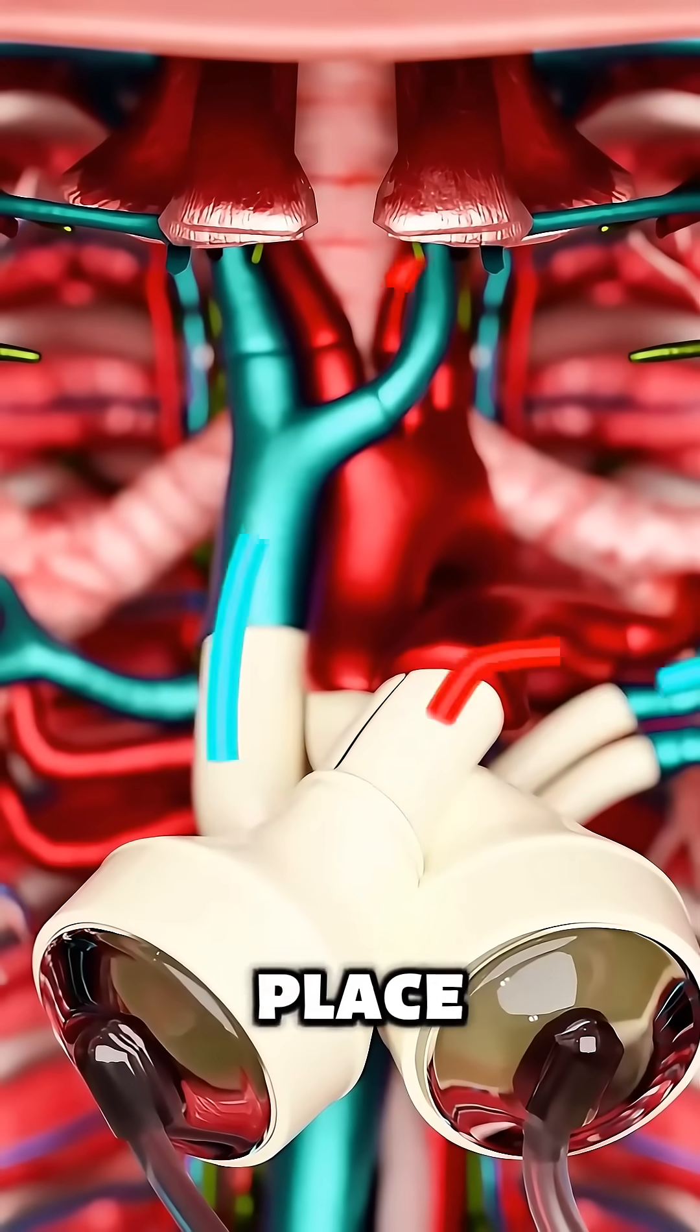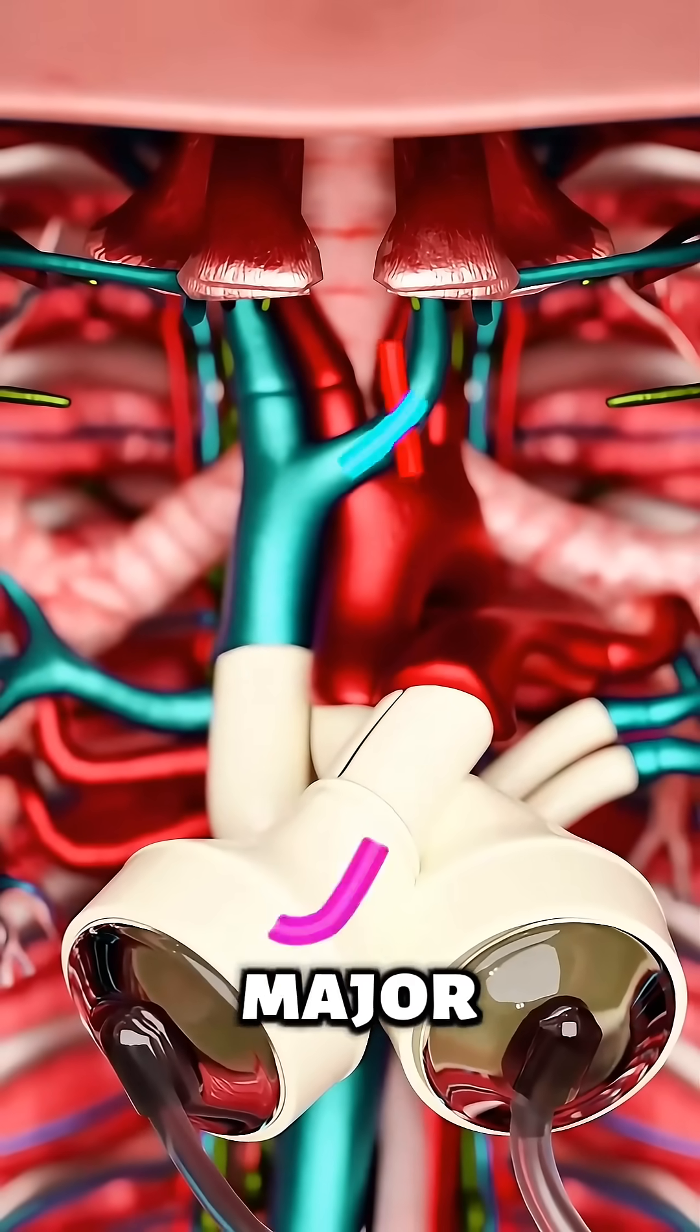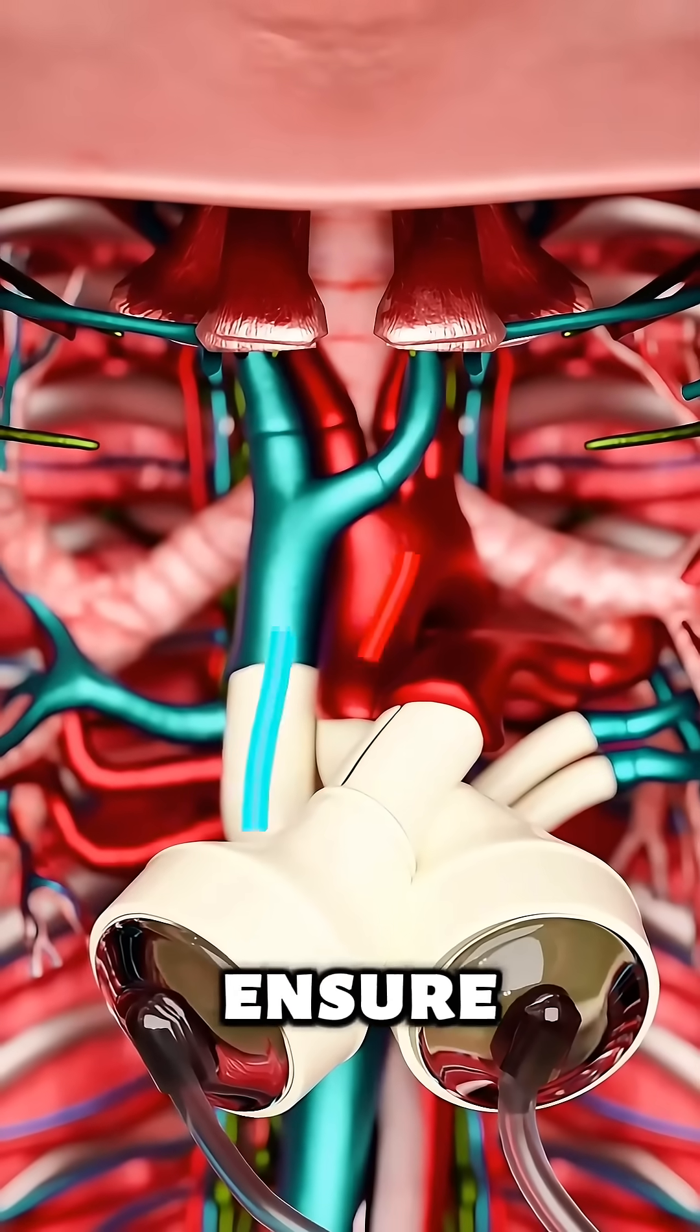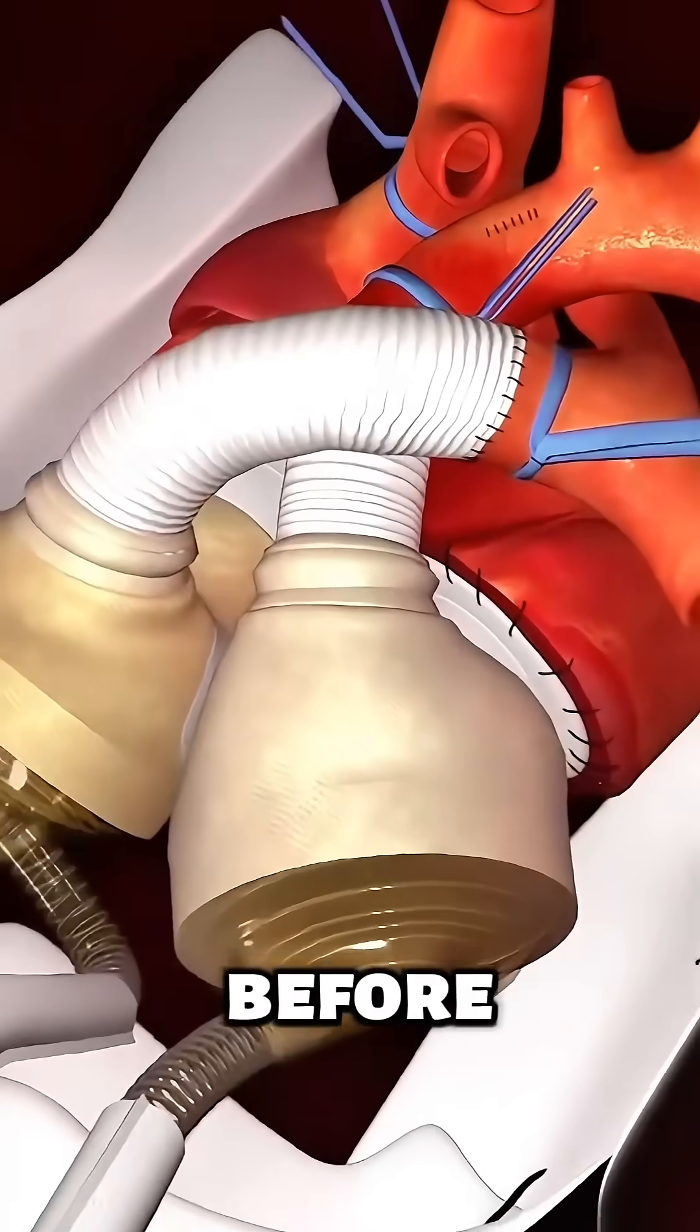Once the artificial heart is in place and properly connected to the major blood vessels, doctors ensure everything is working smoothly before closing the chest.